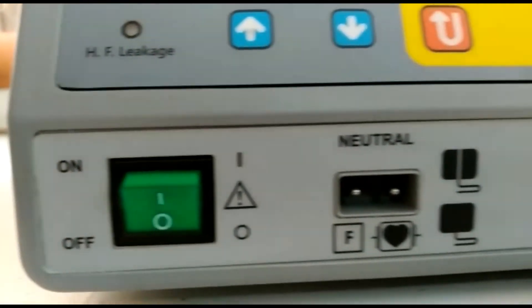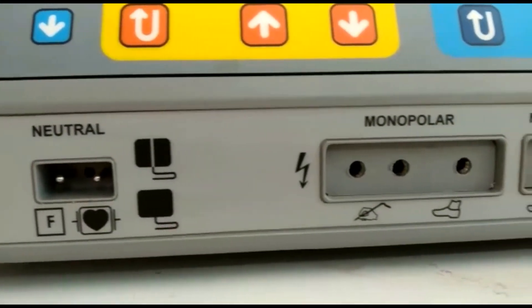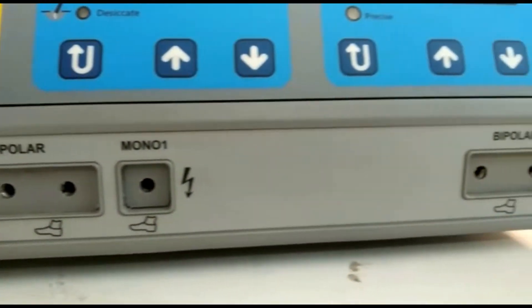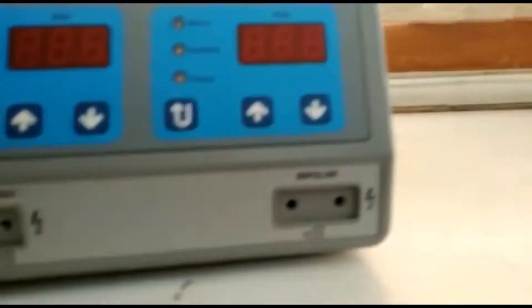The next socket is for the patient plate. It is recommended to use a split patient plate, either disposable or reusable. Then you have the monopolar socket — the three-pin is for the monopolar pencil and the single pin is for laparoscopic or urological procedures. And then you have the bipolar socket.